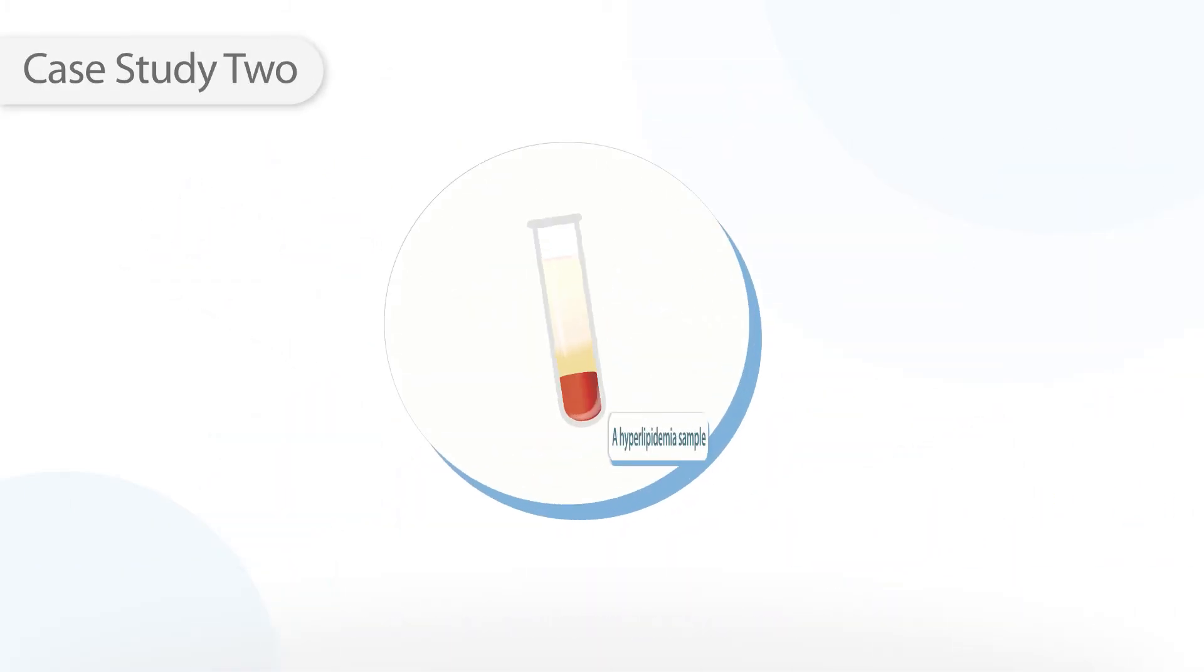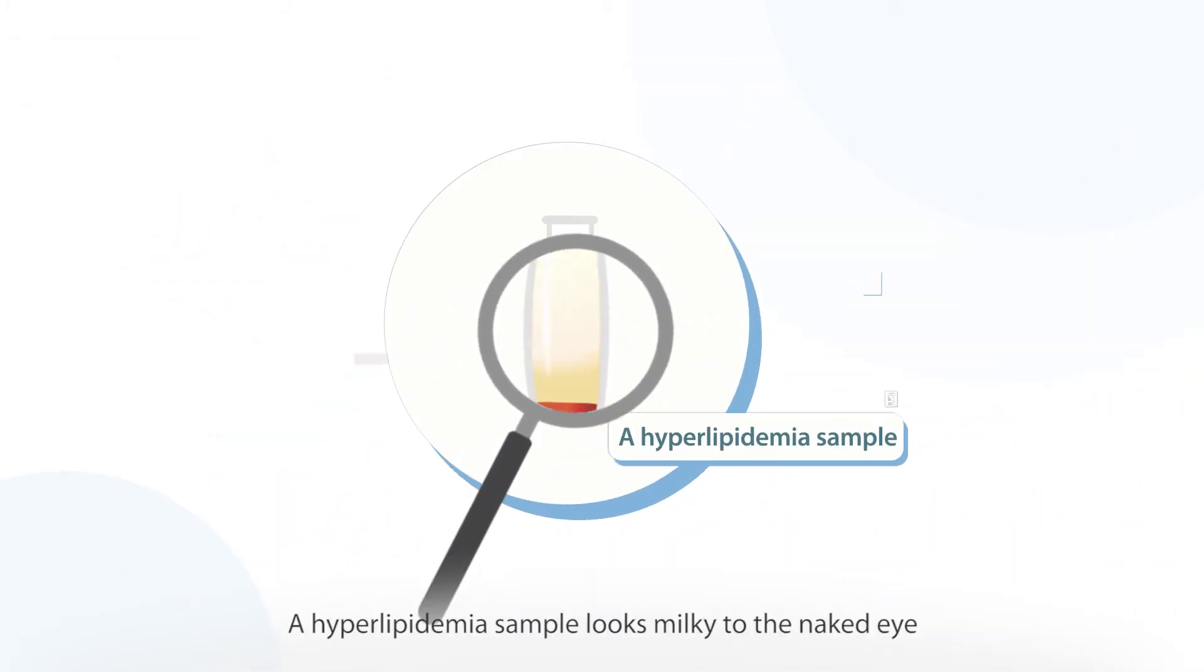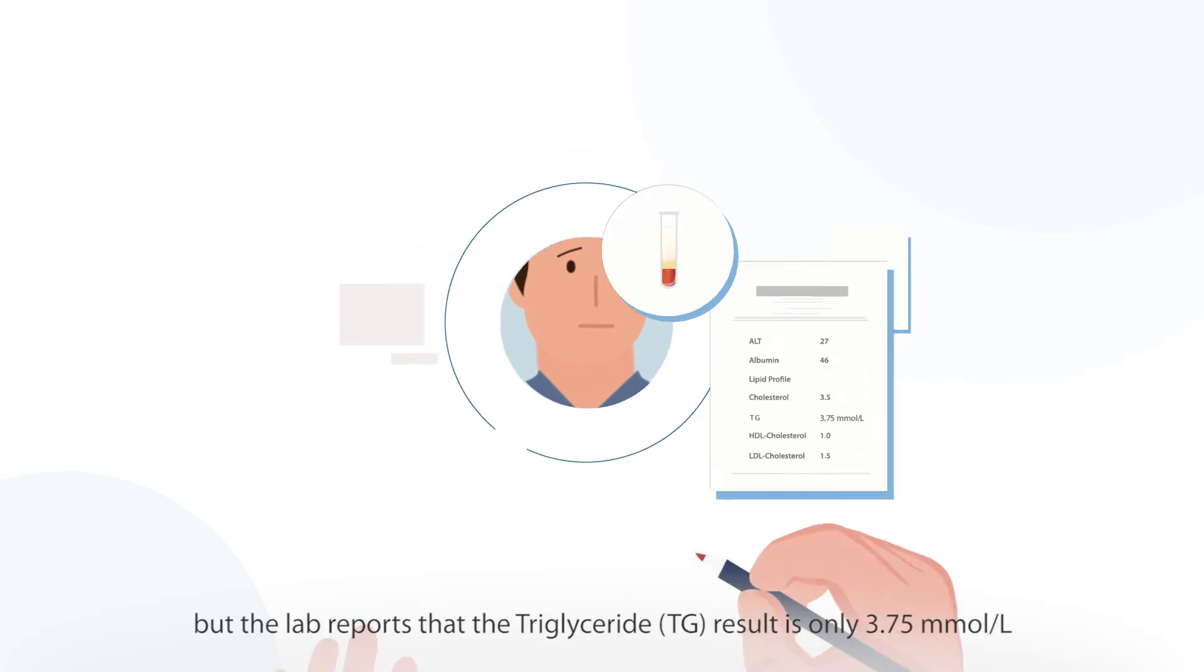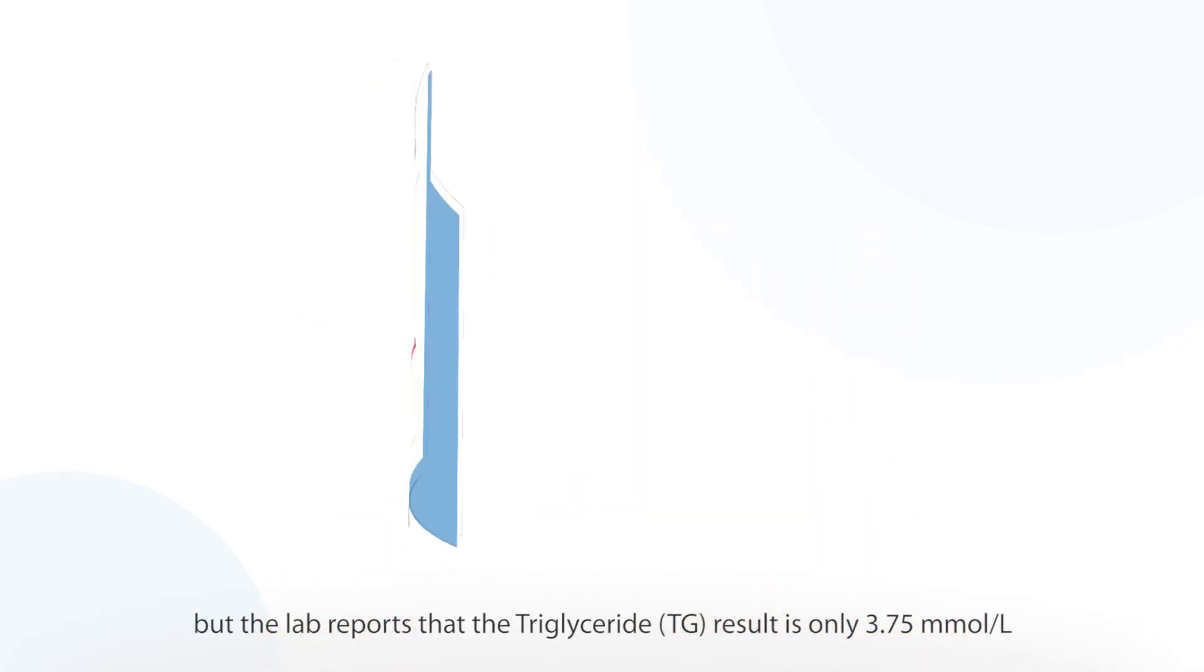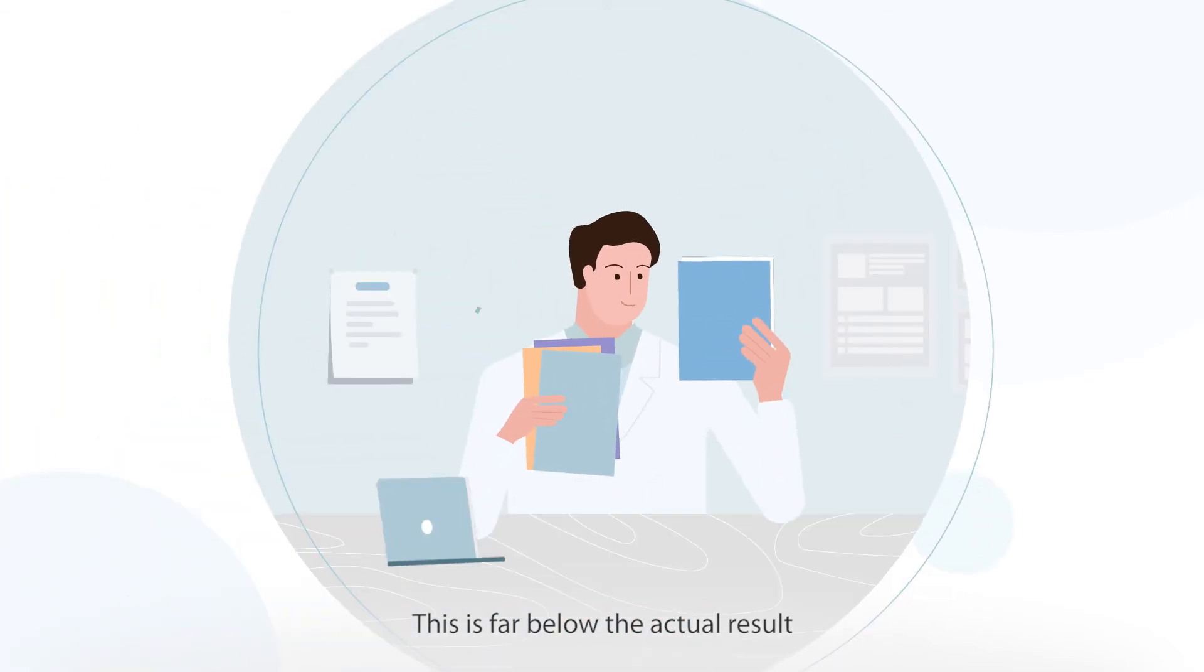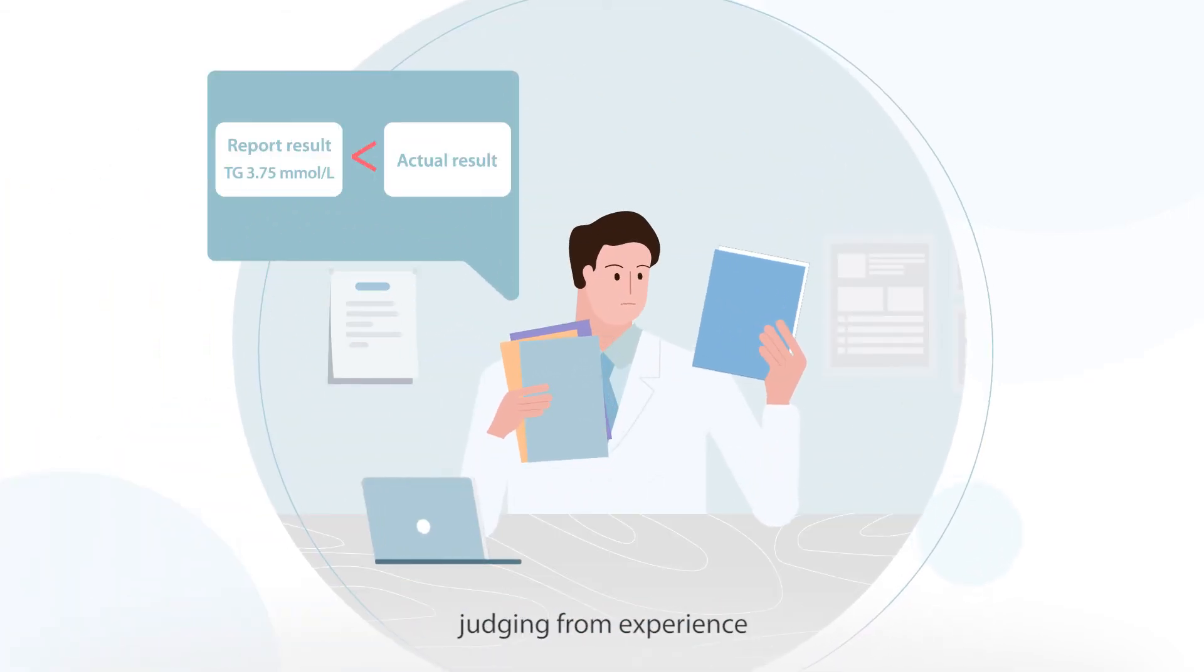Case study 2. A hyperlipidemia sample looks milky to the naked eye but the lab reports that the triglyceride result is only 3.75 millimole per liter. This is far below the actual result judging from experience.